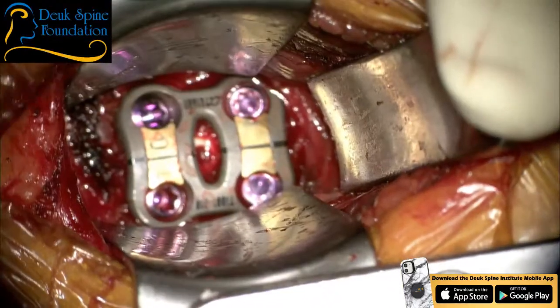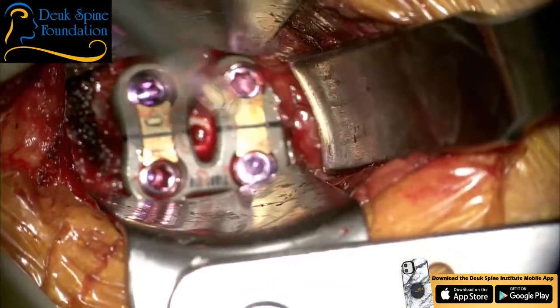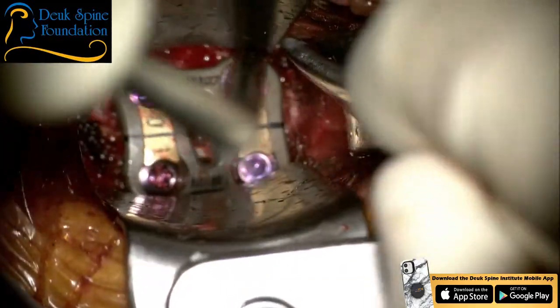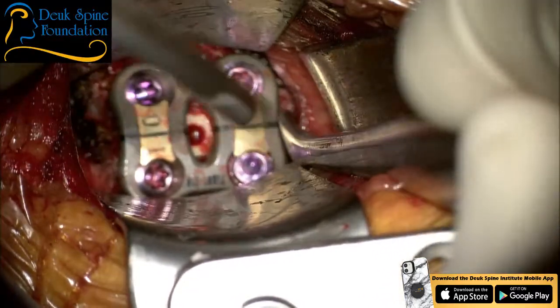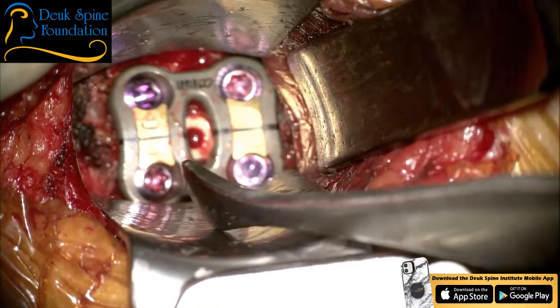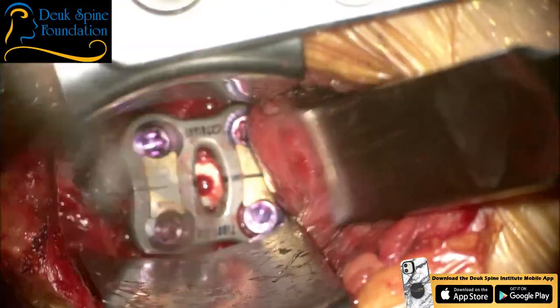The plate appears to be flush with the spine. We're going to check that. Stay where you are. Suck for me, please, Penfield. There's the spine right there. It's looking good. We didn't trap the soft tissues. The bottom of the plate is in the middle of the vertebral body. We got a nice cage in there. Everything's looking good. I'm happy with that. Dr. Patel, you happy? All right, let's come out.